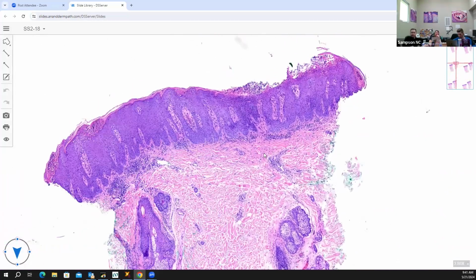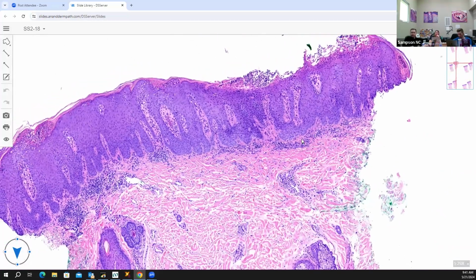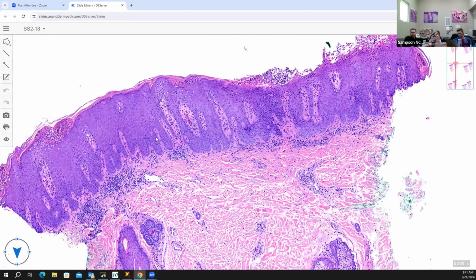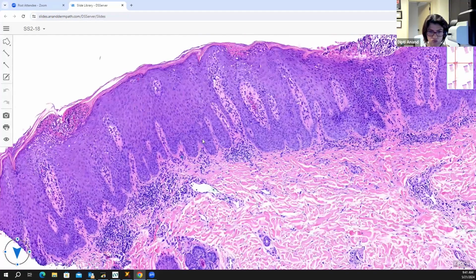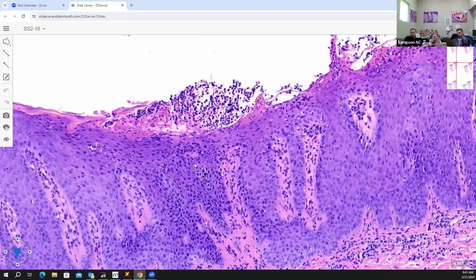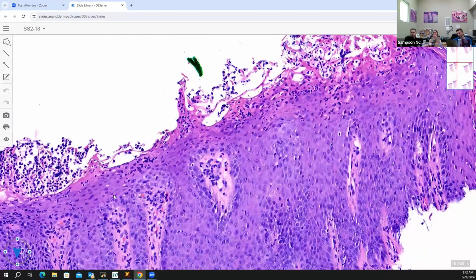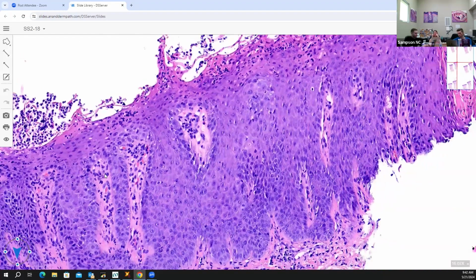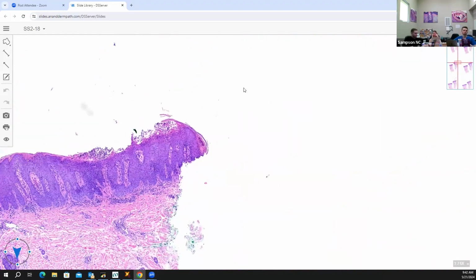So we have regular acanthosis. It looks like in the stratum corneum there's lots of dirtiness going on, maybe neutrophils, or might be like a subcorneal split in there somewhere. My first thought, just looking at that, is potentially organisms that you would want to stain for. I don't really see a granular layer anywhere, so you could also think of a pustular psoriasis.